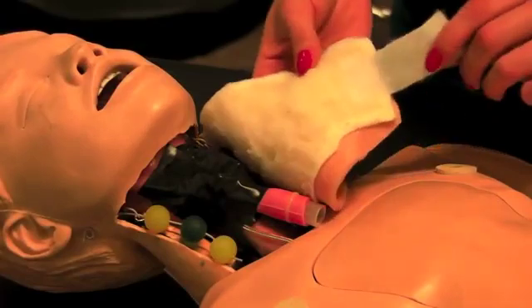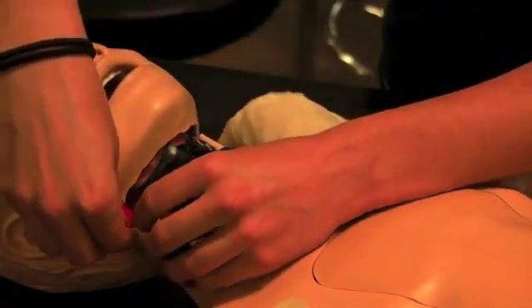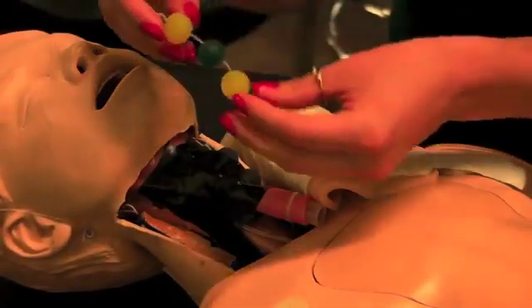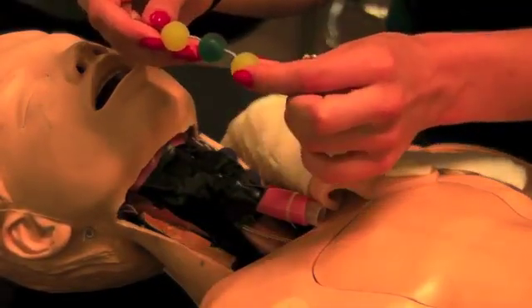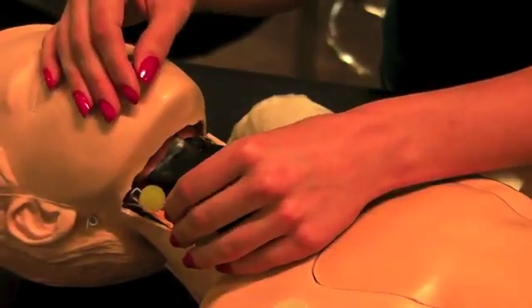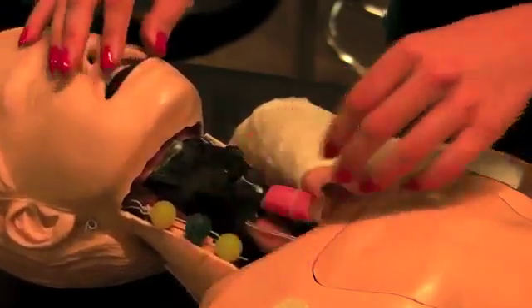The neck skin is easily removable with Velcro pieces, and the lymph nodes are manually interchangeable. You can just hook them onto a wire, and the lymph nodes themselves are also interchangeable — you can put different sizes on to simulate enlarged lymph nodes.